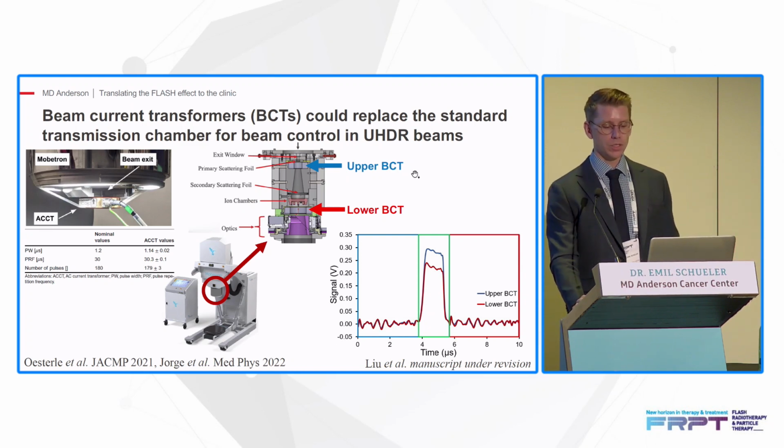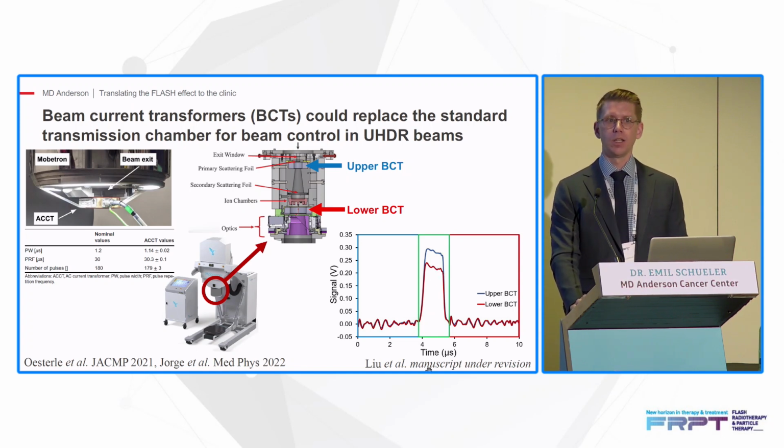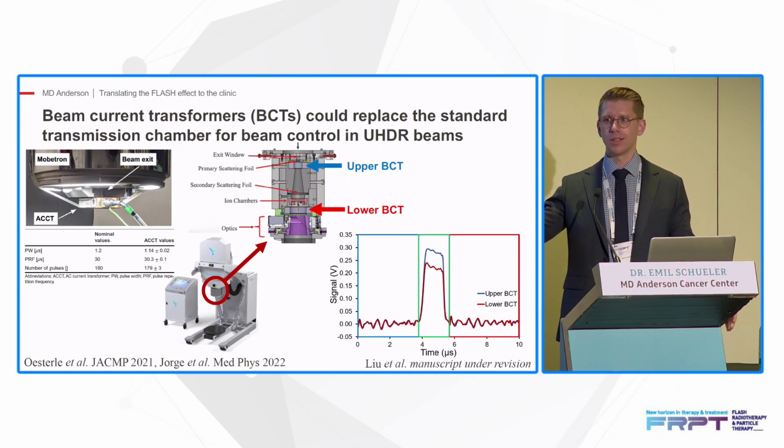And here you can see there are 2 BCTs in the head of the Mobetron, and they can be used as MU1, MU2, relating that to how we're doing it clinically today.